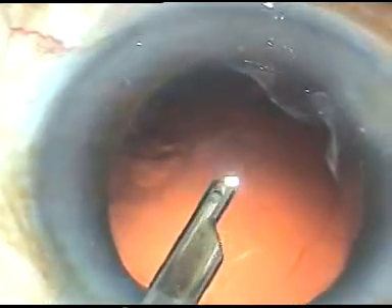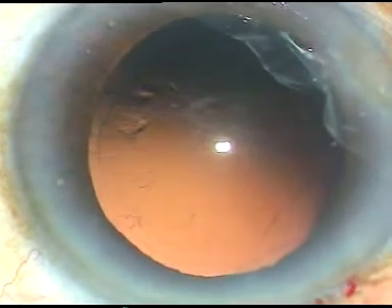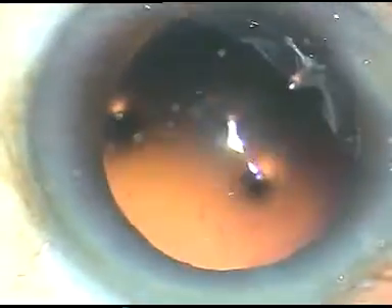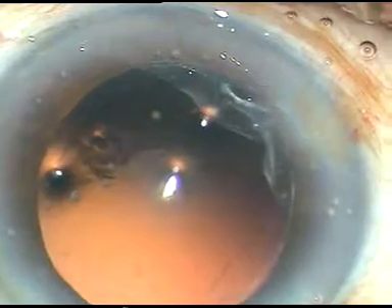The posterior capsule at the center is at a deeper level, and unless you come forward, you will just pierce through the posterior capsule. At this moment, I am polishing the posterior capsule — a very good technique to polish with fluid jet. This is the irrigating probe. Just use the irrigating fluid to dislodge the cells from the posterior capsule, and it will be polished very nicely in a very short time.